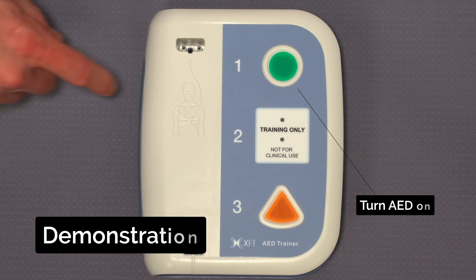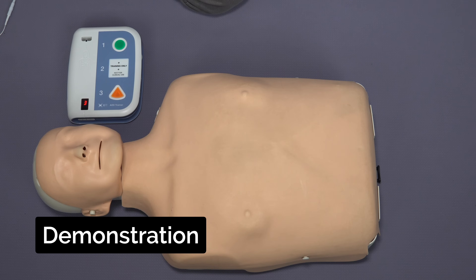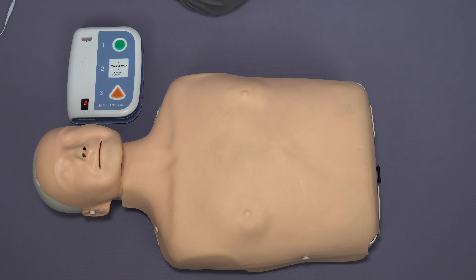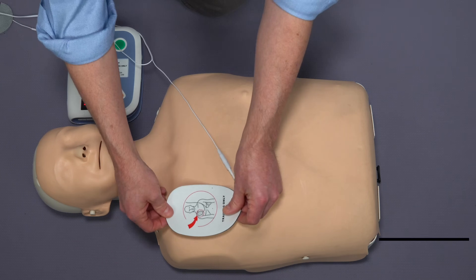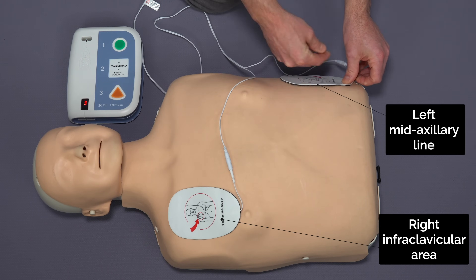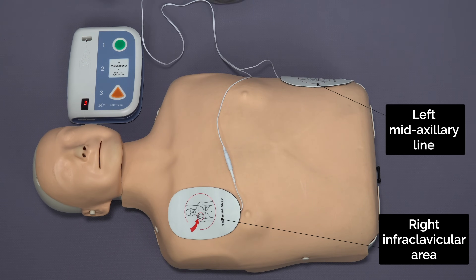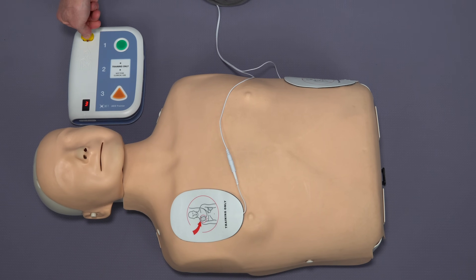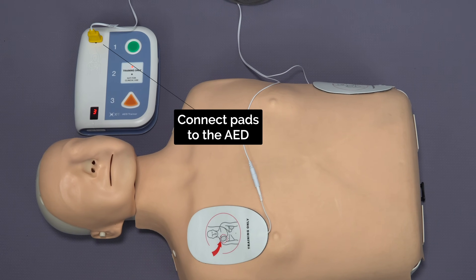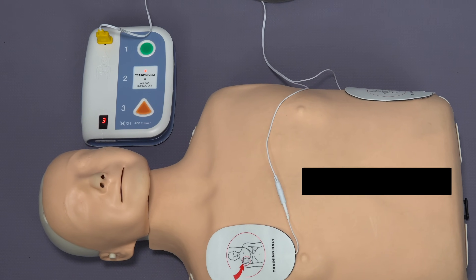Firstly, turn the defibrillator on. Then place the pads in these positions — here and here — then connect the pads to the defibrillator.